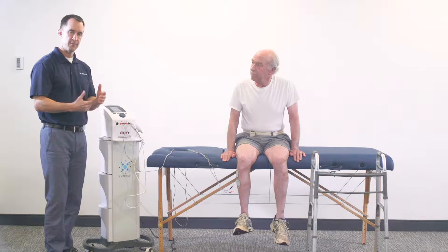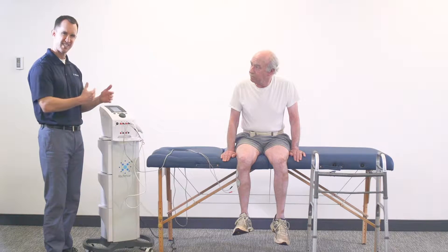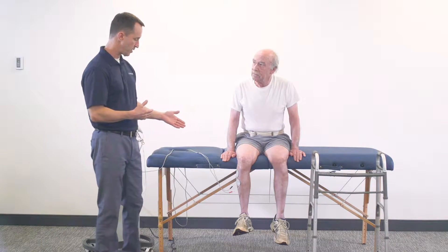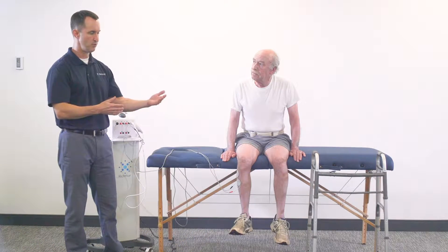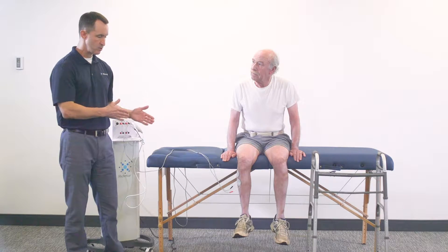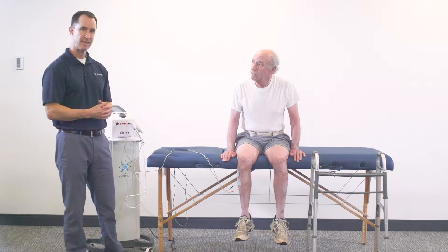Since it's on a continuous on time, the timer has already begun and we don't have a cycle time. We can do one of two things: first, we're going to go ahead and do dorsiflexion while it's on. The next progression is to incorporate more of a functional activity — we can pull the walker over, have the patient slide down, and then do some step forward and step back to help facilitate proper ambulation and gait.